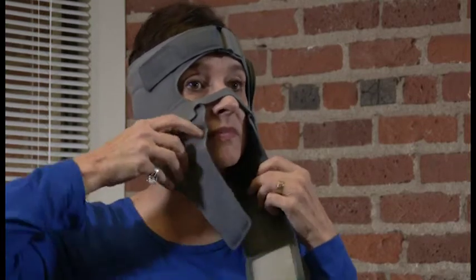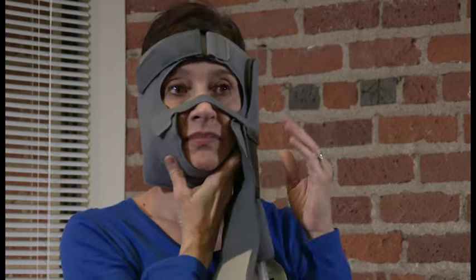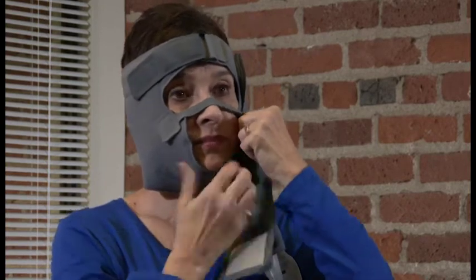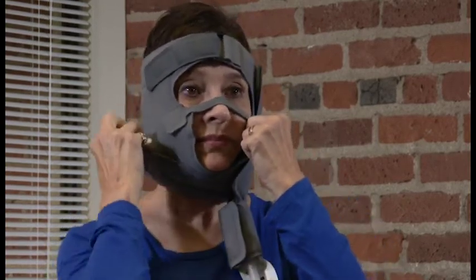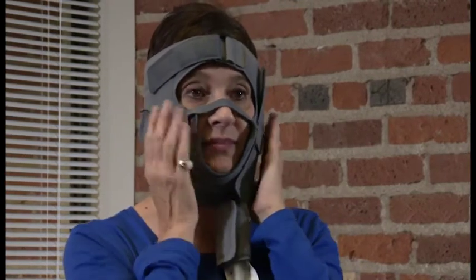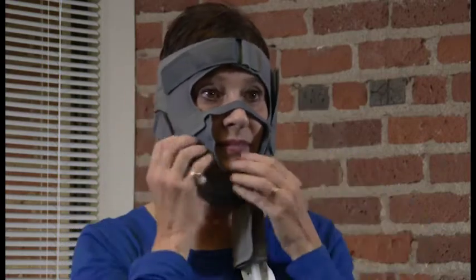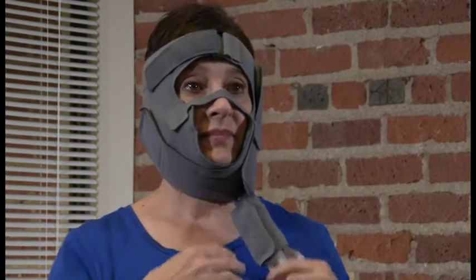Lastly, find the chin straps located below the left and right cheeks. Adjust the right inner chin strap so it fits snugly under the chin. Then, secure the left outer chin strap over the right inner chin strap and fasten using the hook fasteners. Adjust as needed to achieve a contoured fit around the chin.